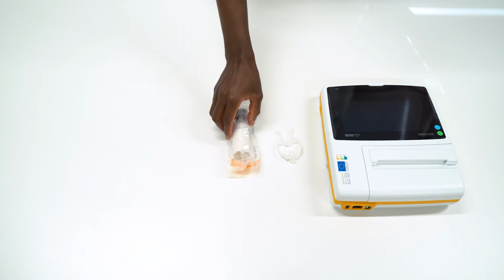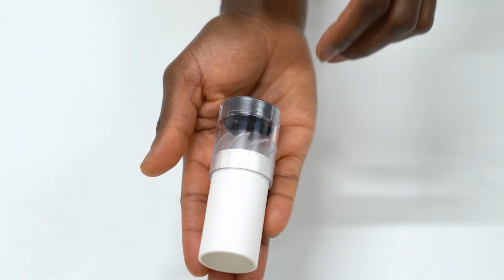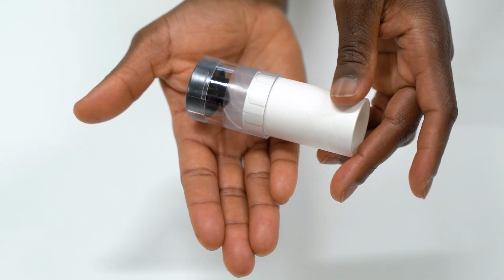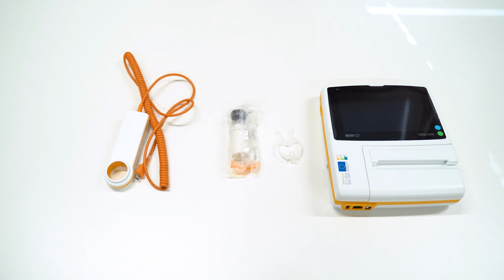Mouthpiece is connected to the turbine. It ensures that the patient's breath is directed into the device for accurate airflow measurement. A turbine. It is either reusable or disposable. It is crucial for measuring airflow accurately. The disposable turbines are made of plastic and are replaced in the next spirometry test, while reusable turbines are properly disinfected before being utilized by the next patient. The turbine we used in the video is a disposable one.